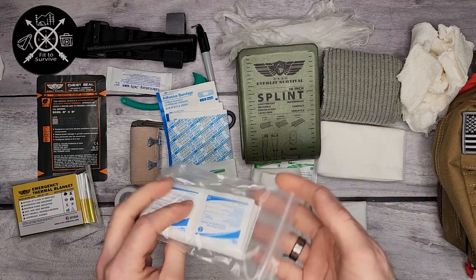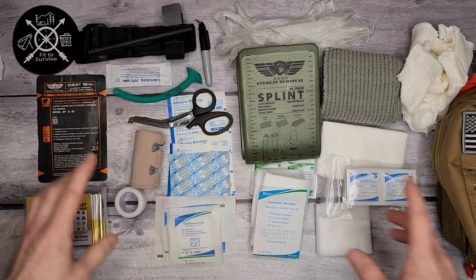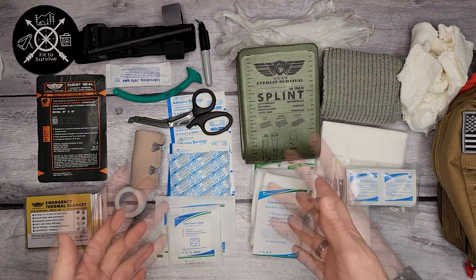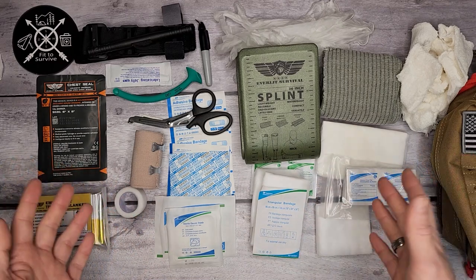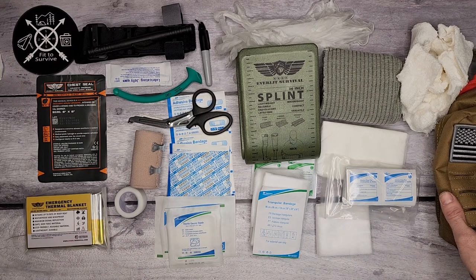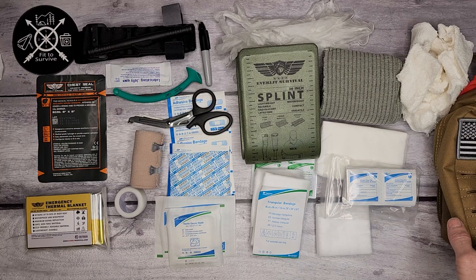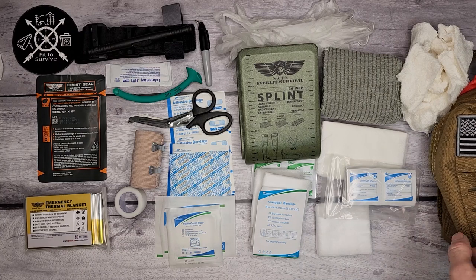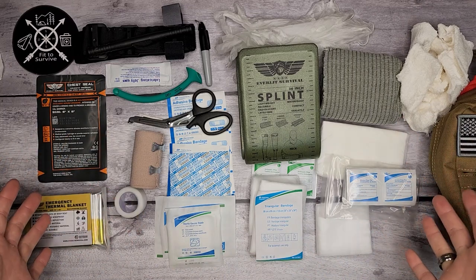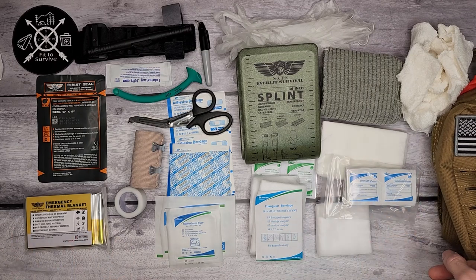That is everything in this trauma kit — it covers the basics. You're not going to see any pills, no painkillers, nothing for allergies. If those are things you want to add to make this a complete first aid kit, there's plenty of space in the pack to add pills and more. But this is just the basics — it's the skeleton, per se. Overall, I'm very impressed with everything they've included.